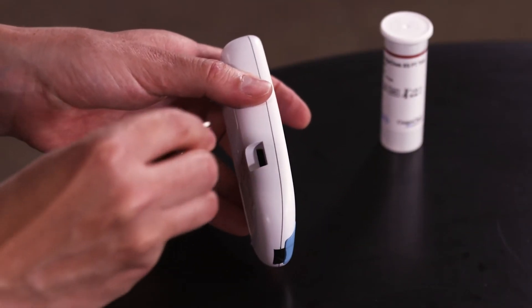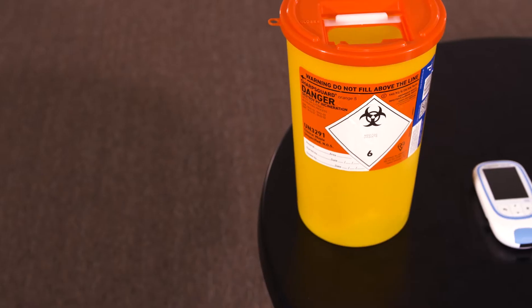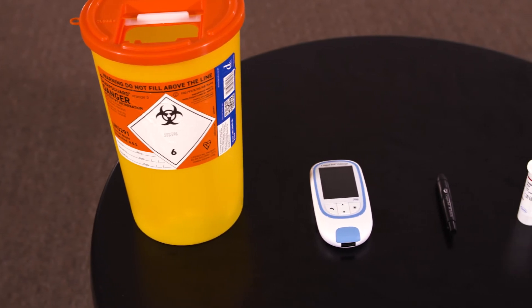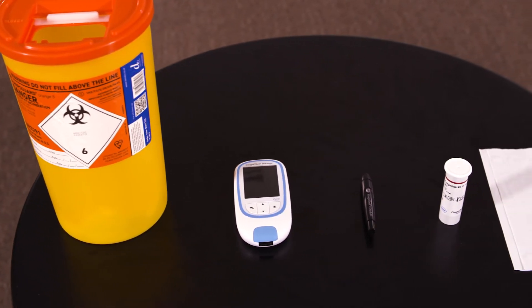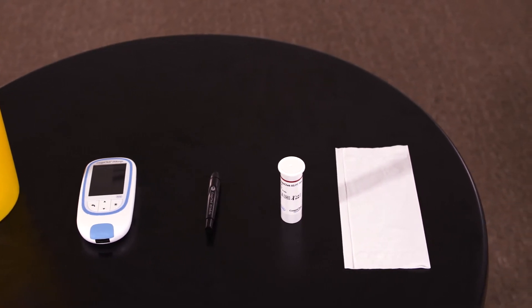Before performing a test ensure you have inserted the code chip into the meter. If the meter has not seen the correct code chip you will not be able to perform a test. Ensure you have everything you need including the meter, the AccuCheck SoftClicks pen, strips, a suitable container to dispose of used equipment and tissues.